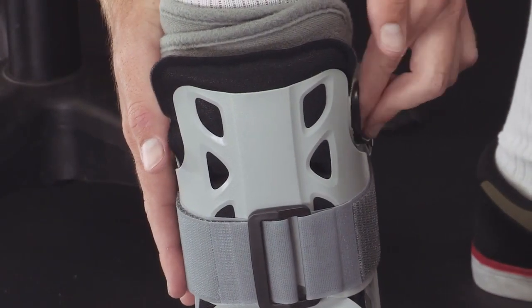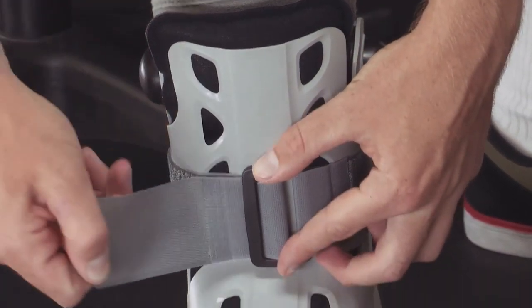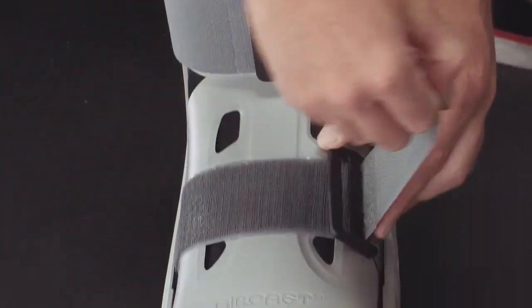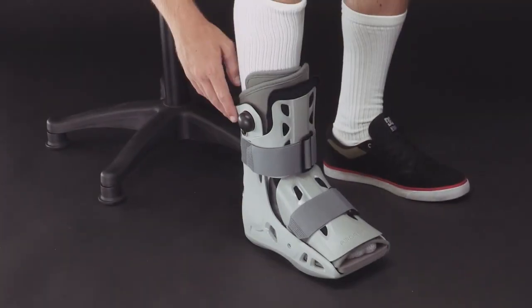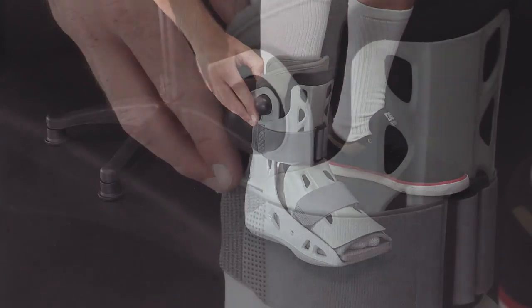At high altitude, the air cells will expand beyond their optimal level. In this case, you can adjust the pressure by tightening or loosening the straps. If you over-inflate the air cells, you'll need to deflate them. To deflate the air cells, press and hold the small release button until the pressure is comfortable.